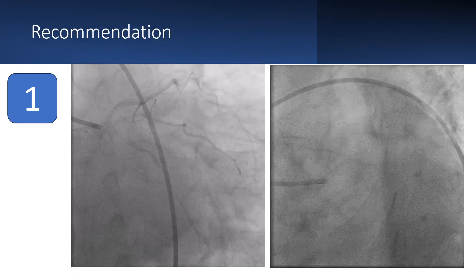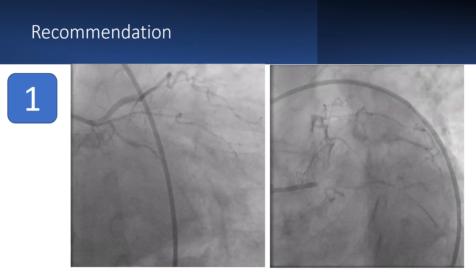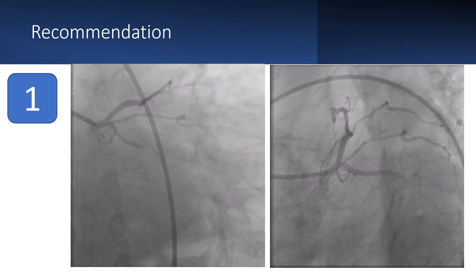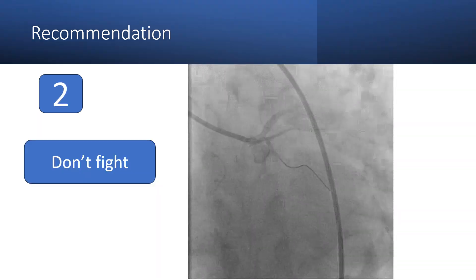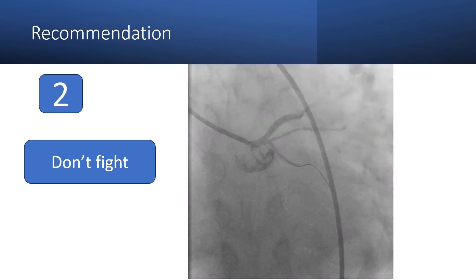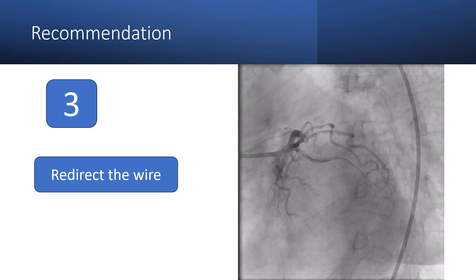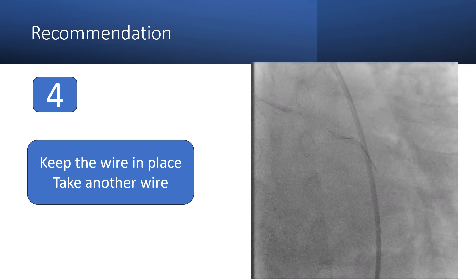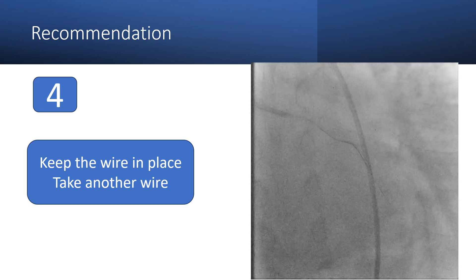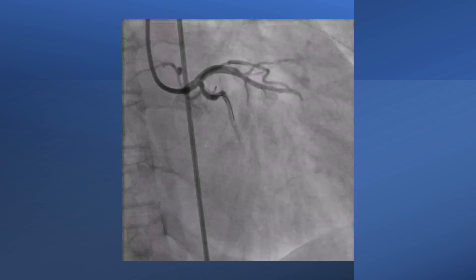So the recommendation is: first, when you find a near-total occlusion, take multiple views to identify a micro-channel that you can negotiate with the wire. Look at this circumflex with distal subtotal occlusion in a patient with unstable angina. If your wire is stuck at the lesion, don't fight the lesion — redirect the wire. If there is still resistance, put another wire; keep the first wire in place and take another wire. Look here where the second wire made its way through the true lumen and passed distally. And this is the final result.